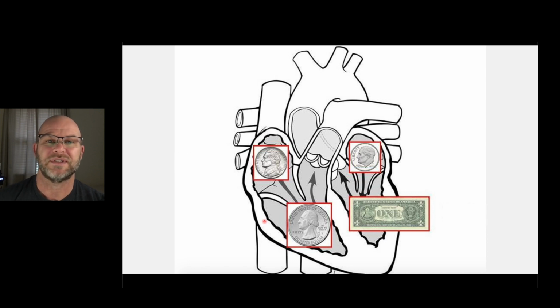One of the things you talk about with sats is if we measure sats in the vena cava, up here and down below, let's say the oxygen saturation is 60. When we get into the right atrium, all of a sudden it's 72. How do we go from deoxygenated blood to partially oxygenated blood before we made it to the lungs? We have some type of mixing going on. That would be a shunt, and the most likely place for that type of mixing is from the left atrium coming through the septal wall to the right atrium.